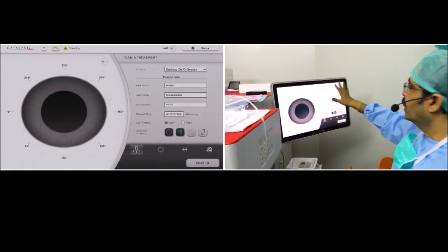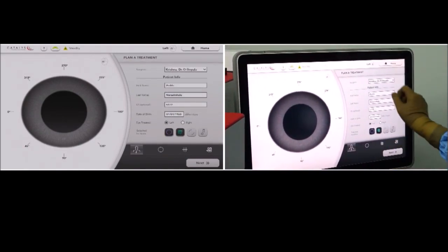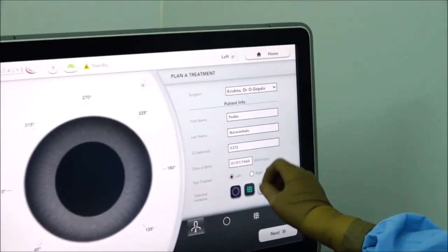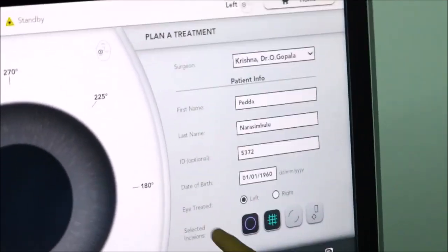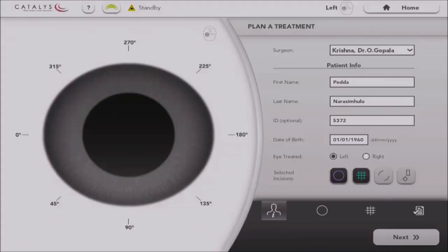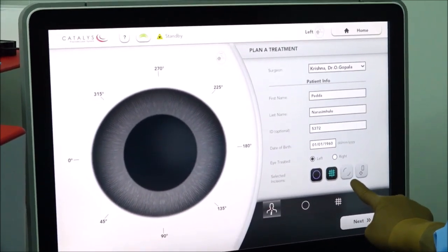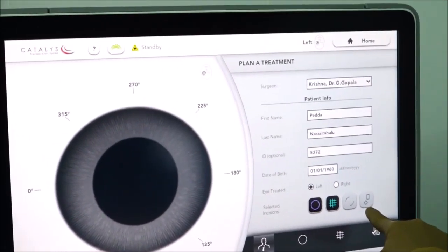We feed the data into the monitor here. We have the plan of treatment. First, we enter the geographical data of the patient — the name, age, MRD number — and fix up either left or right eye, and then decide what steps you are going to do. The first step is capsulotomy, the second is fragmentation and segmentation of the nucleus, the third is arcuate incisions, and the fourth is the corneal incisions, which you can choose to make or not.